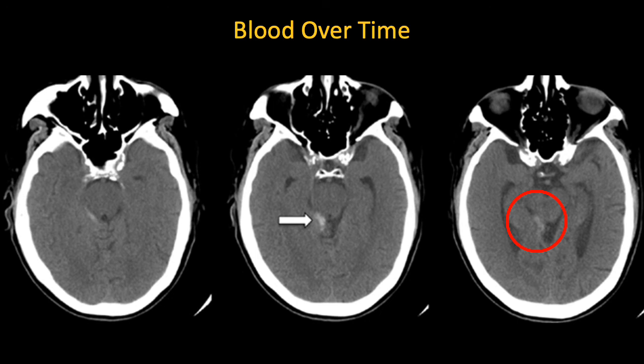This is a typical example of a bleed: on the image on your left at the ambient cistern there is a small subtle hyperdensity. Three days later bleeding has increased and caused shifting relative to the ambient cistern. More importantly, the cerebral aqueduct — seen lateral to or medial to the bleed where the arrow points — has become smaller. Over time you also see shifting of the pons and colliculi due to increased pressure built up in that cavity.